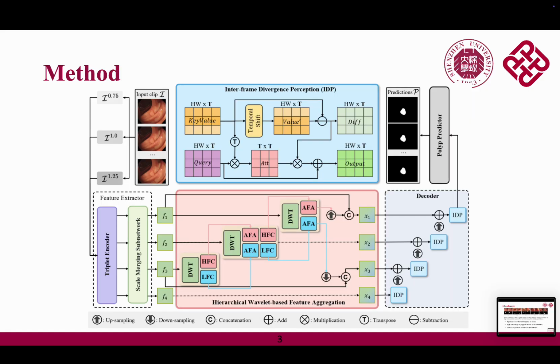Now I will introduce the overall pipeline of WavePolyp, and at the same time briefly explain the ideas of our two key modules, HWFA and IDP. Starting from the left side of the figure, the input is a video clip with T frames.